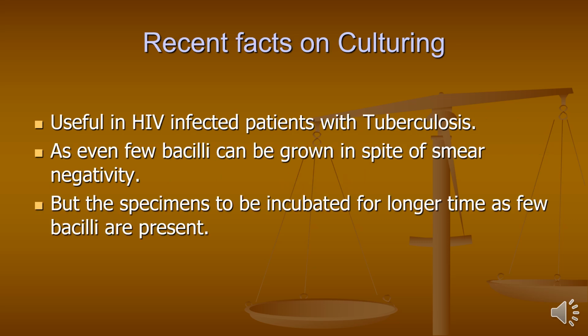So, a recent fact in culturing: it is used in HIV patients. If a few bacilli are present, it can grow, but the specimen needs to be incubated for a longer time, around 8 weeks, as there are few bacilli.